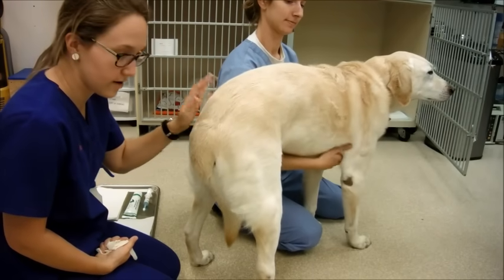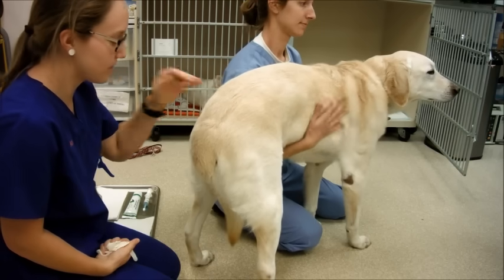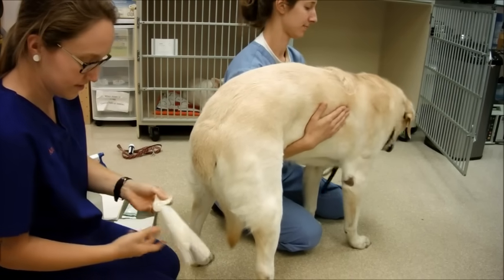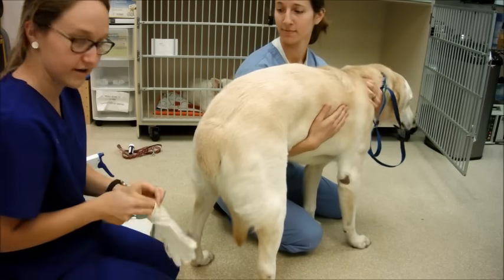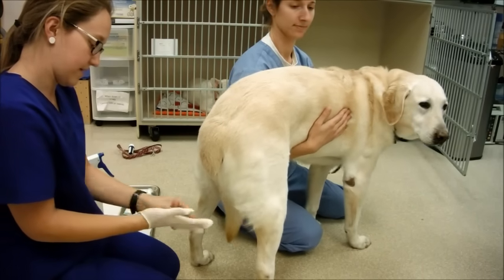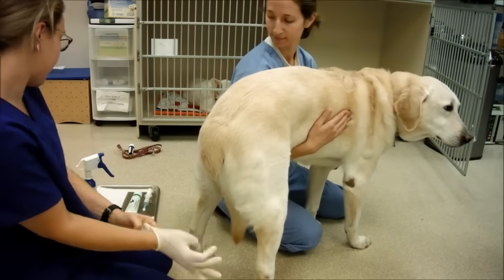Today I'll be performing a simulation of an enema on a dog. This is Champ. I have Dr. Kate applying restraint for me. She's making sure he stays standing because once I start doing things back here, he's not going to be super happy. I'm going to go ahead and put my gloves on and then talk about some of the other materials I have over here.